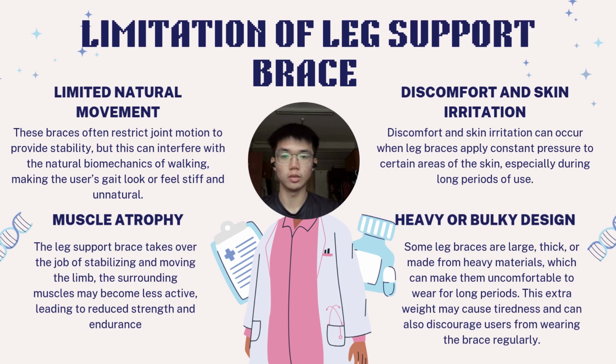Then, I'm going to present about the limitations of leg support braces. The first is limited natural movement. This brace often restricts joint movement to provide stability, but this can interfere with the natural biomechanics of walking, making the user's gait look or feel stiff and unnatural.